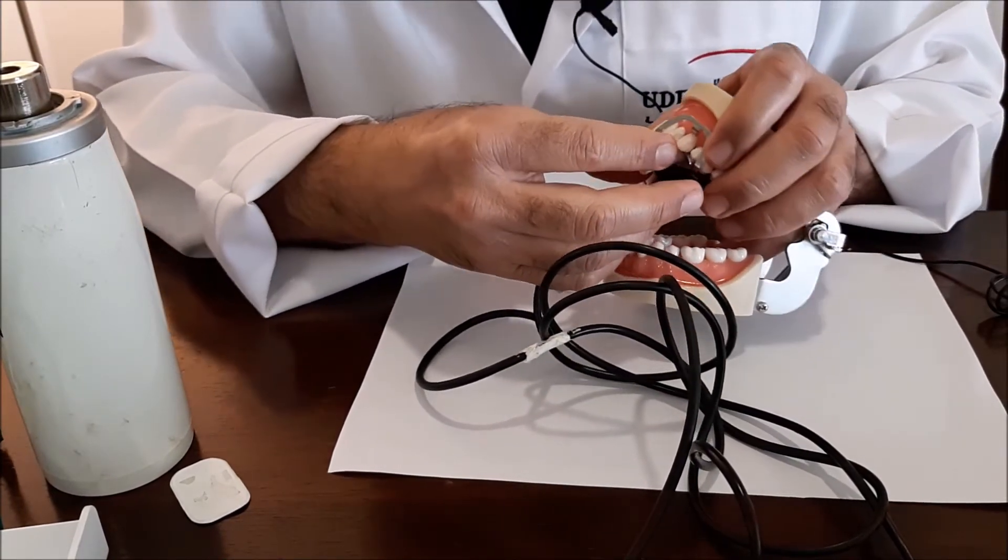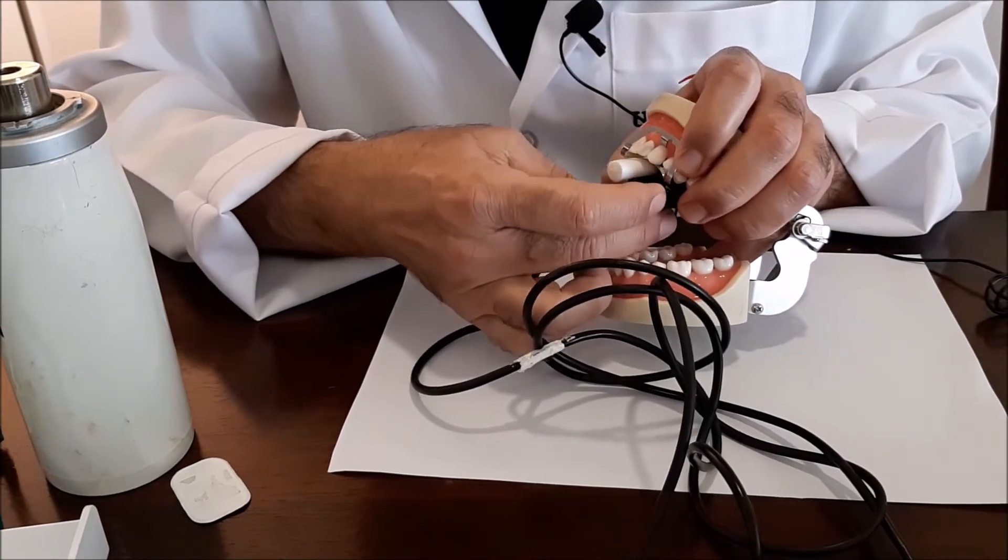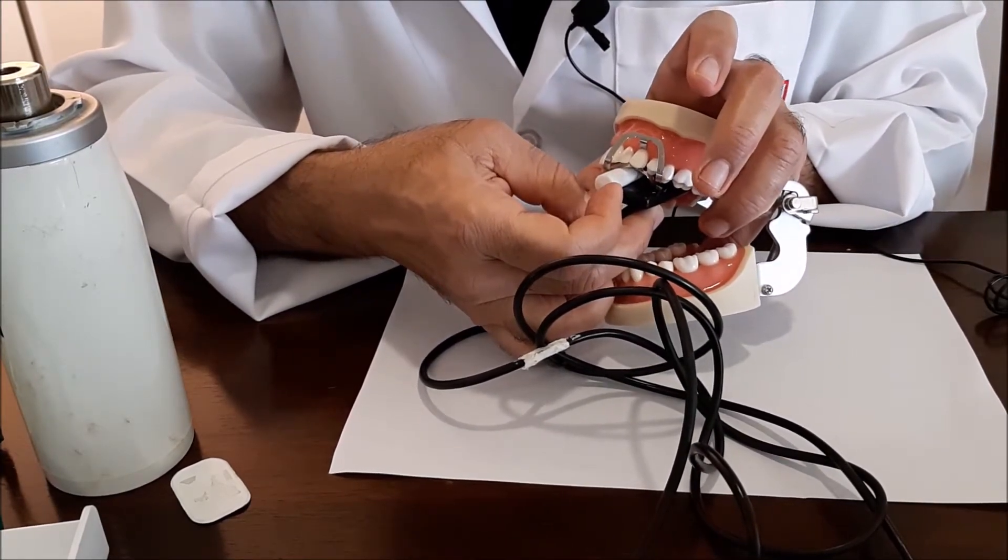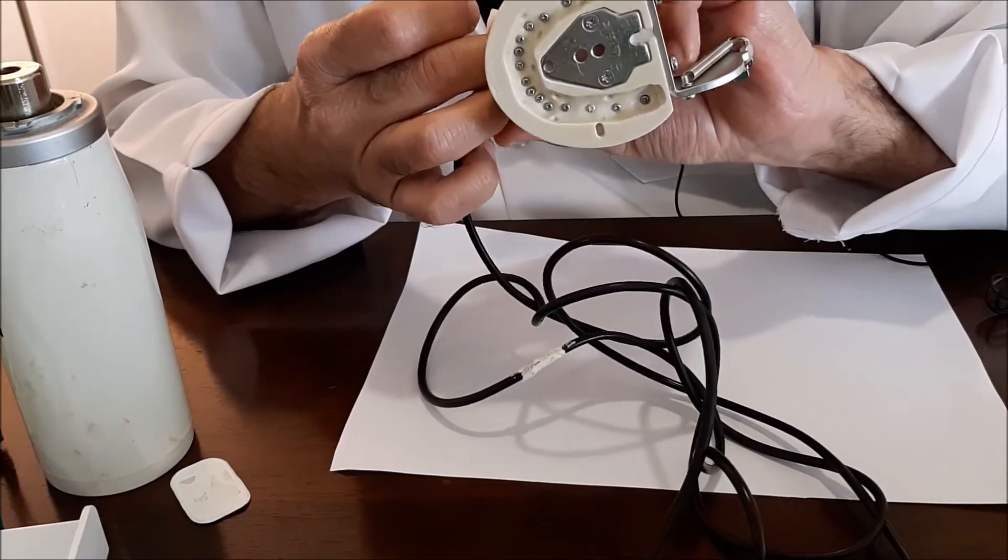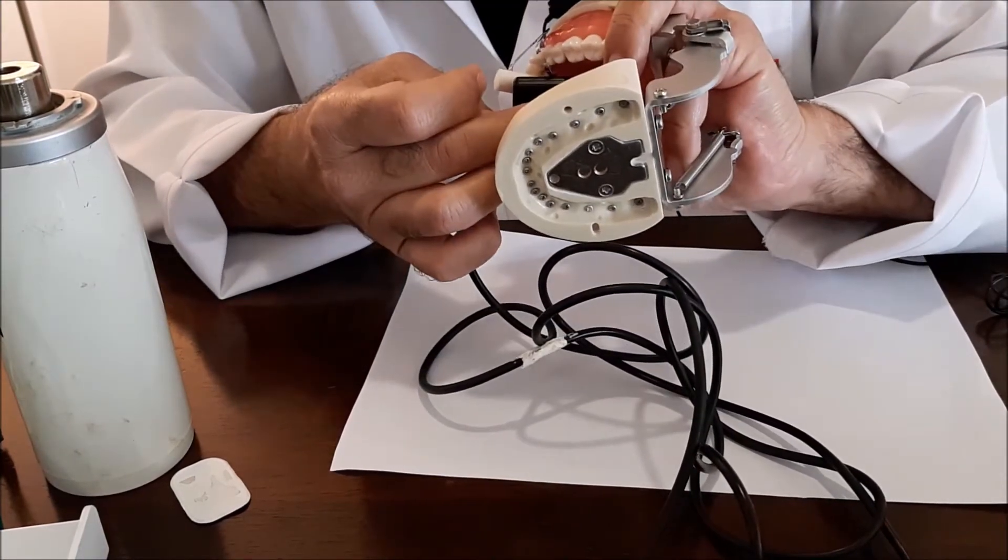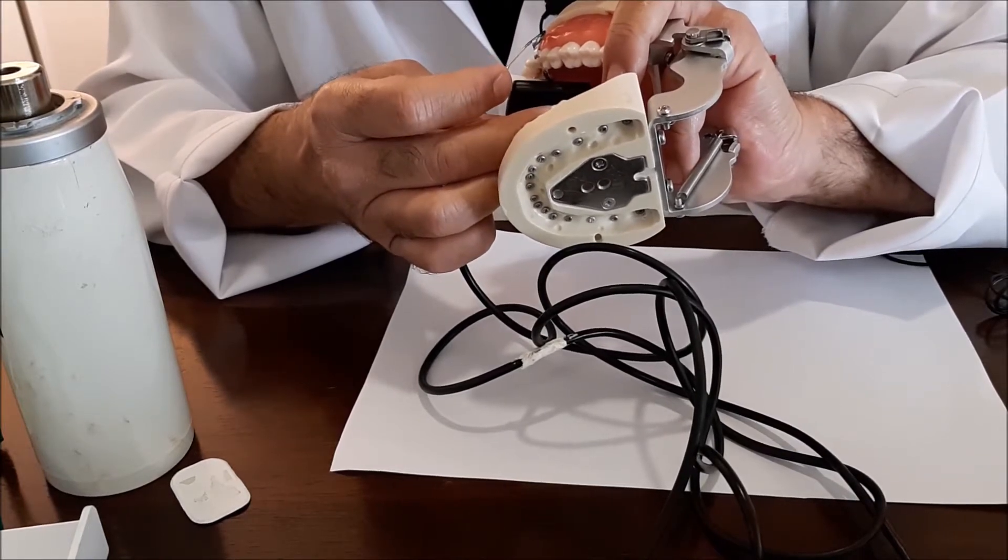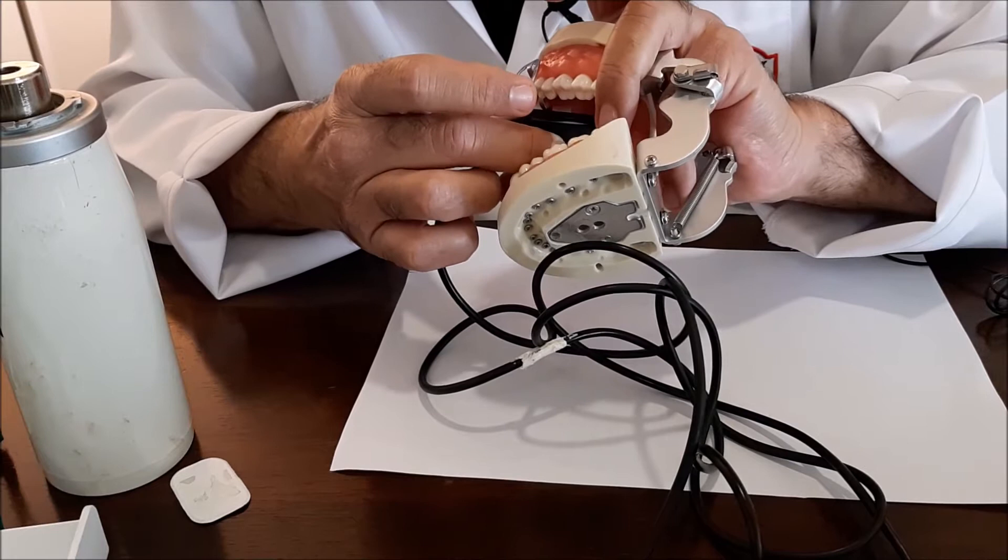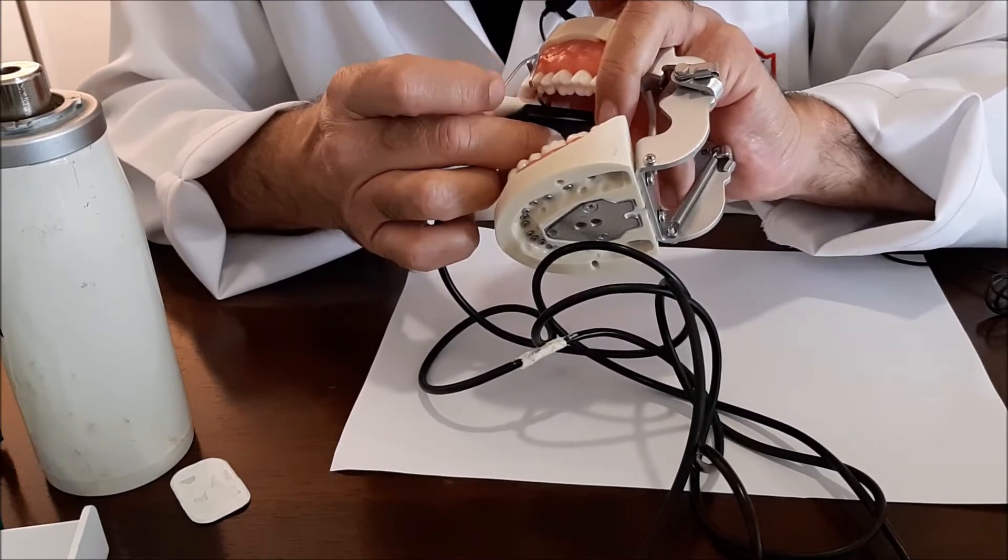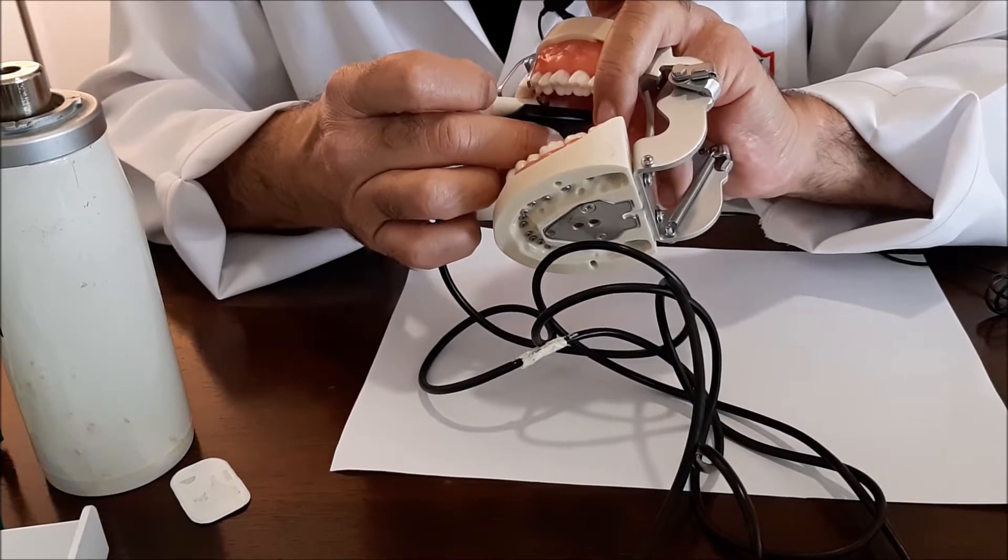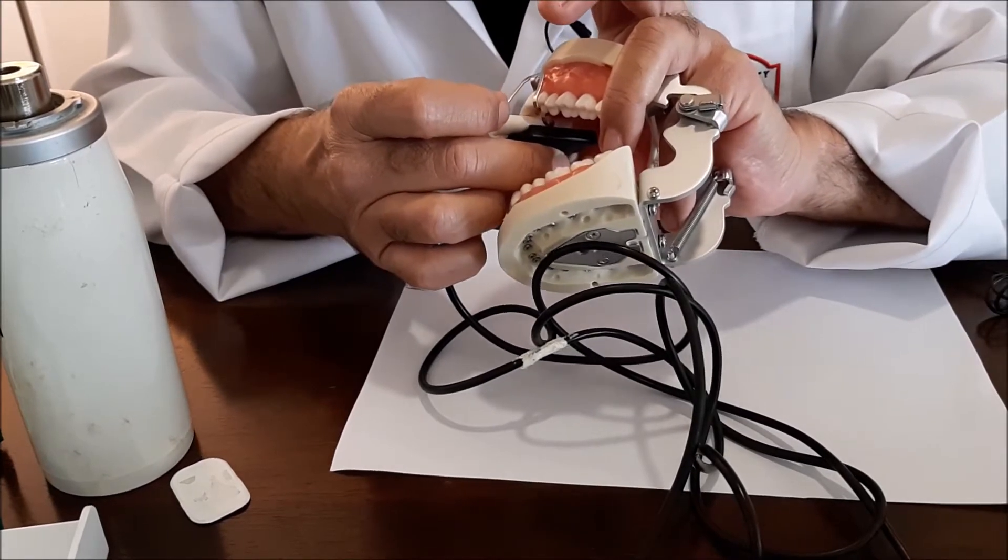So you put it in this way. See how it helps to slide the sensor backwards. And at the same time your reamer is extending from the access opening and doesn't interfere with the cotton roll. And if still the canine is more, the root I mean is very long, what you can do here is there is kind of a maneuver.